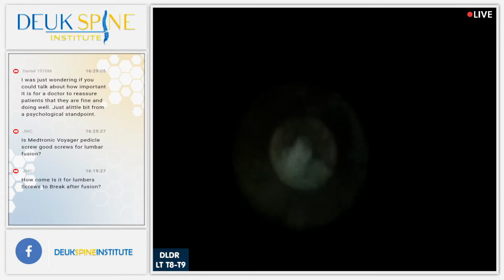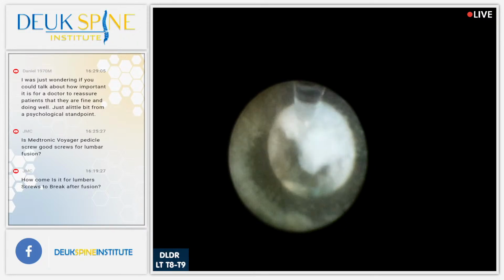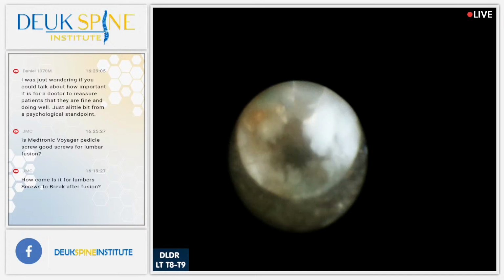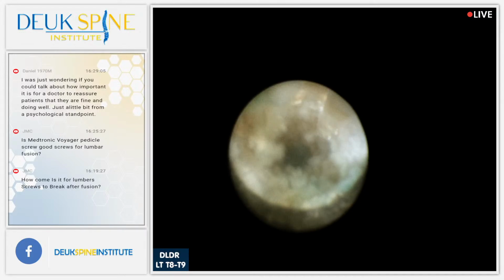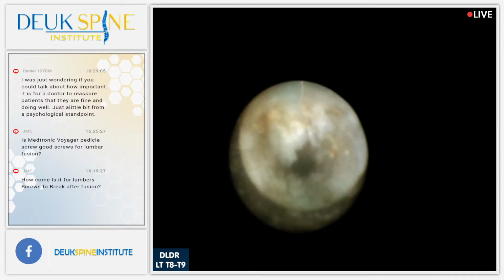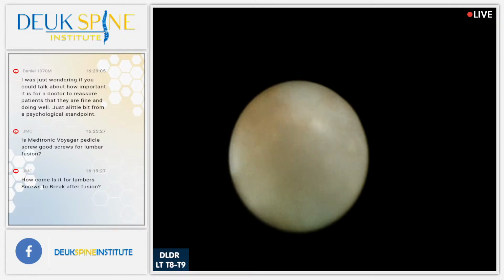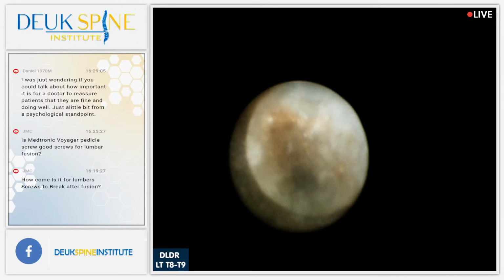Great question. I don't use the Medtronic Voyager pedicle screw system. I don't care for Medtronic personally. Not because their screws are bad, but I don't like their instruments. So when you're looking at instrumented spine fusions, there are two things you have to take into consideration. Number one, the quality of the implants, which is your cages and your screws that we're talking about. Properties of those implants. And the second issue is the instruments you use to put them in, okay?